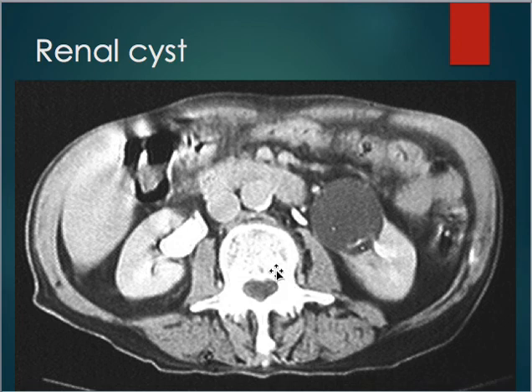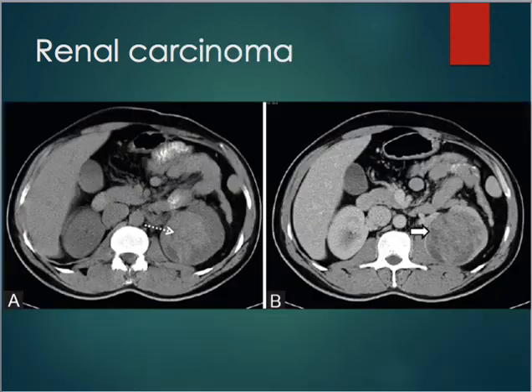This is a renal cyst or a kidney cyst. So here you've got your right kidney and your left kidney here. This is the healthy part, and then this right here is the cyst on the kidney. Renal cysts are one of the most common abnormalities that are found on an abdomen CT. Most of them are benign and not much to worry about, but every once in a while it's concerning and they can be cancerous.